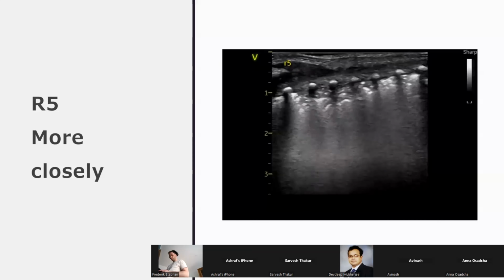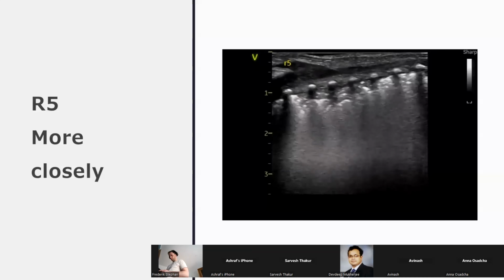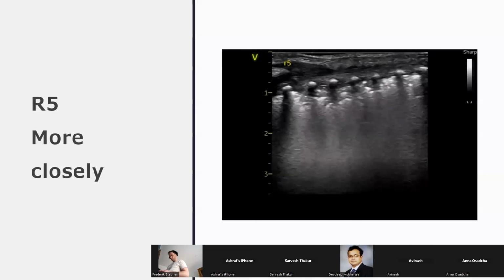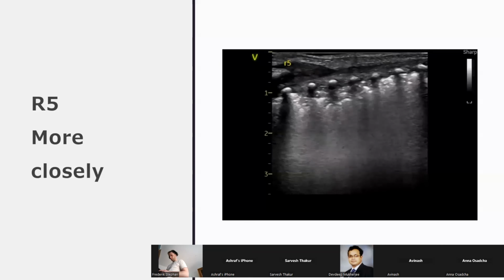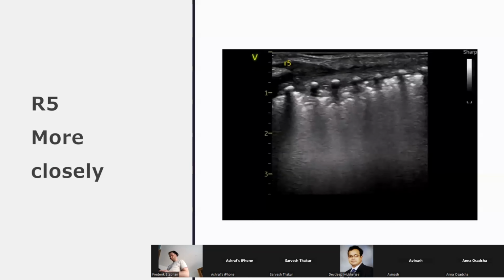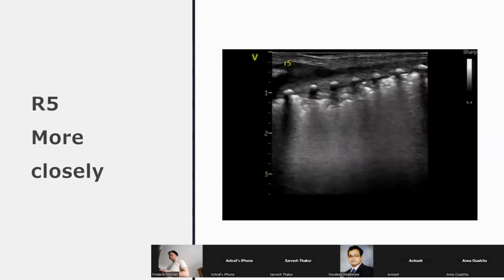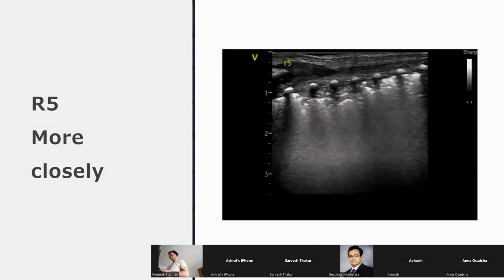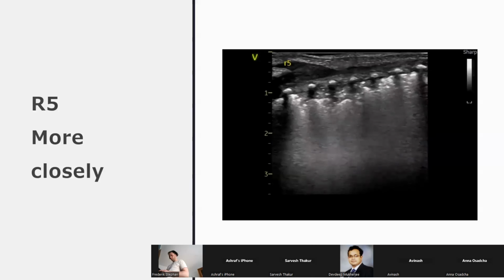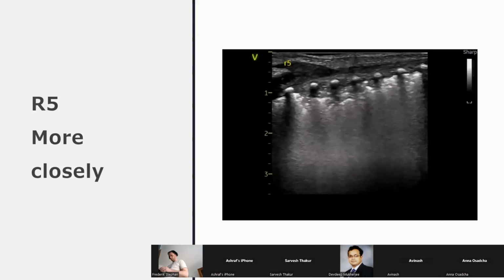The advantage of using lung ultrasound is you can actually see recruitment in real time. The challenge is, remember, you're looking at the area of lung that is de-recruited, that is atelectatic, that is potentially recruitable. What you're not looking at is the area of lung that is normal and seeing what happens to that. That is the detriment here, is fixation error. You can get heavily fixated and babies can deteriorate very quickly. So just be very careful.